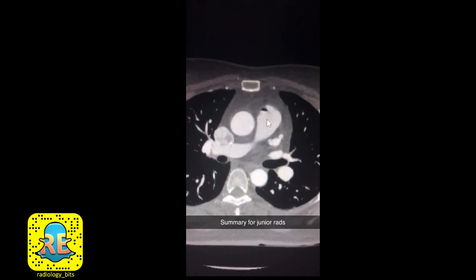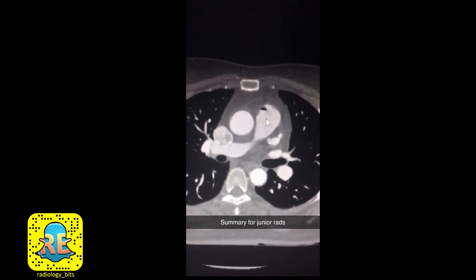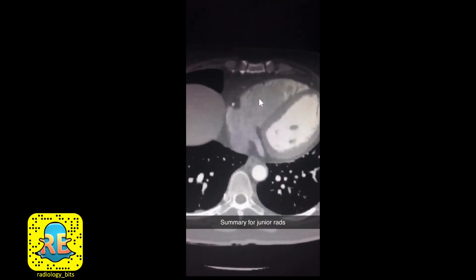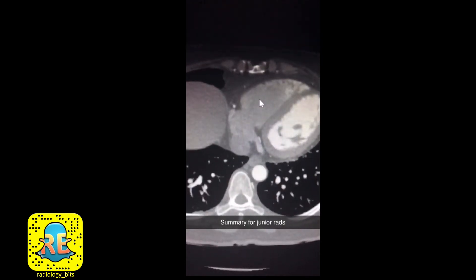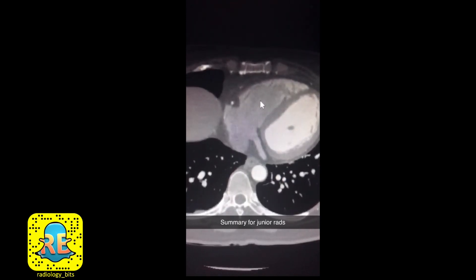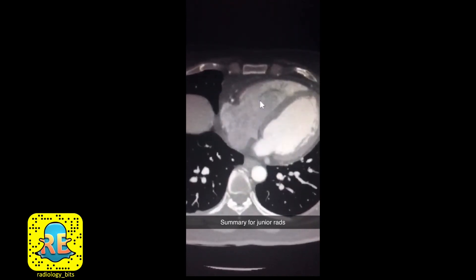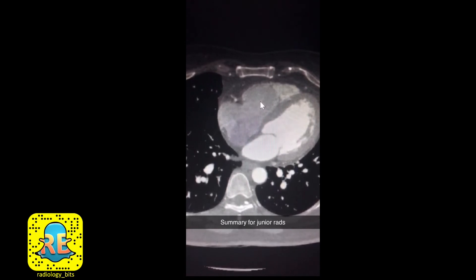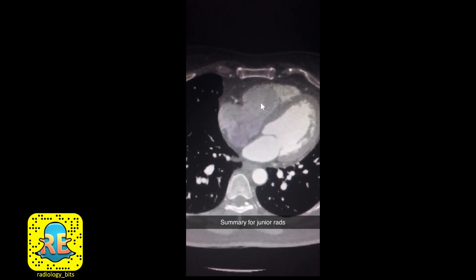To summarize for the junior radiology resident: seeing a few tiny air bubbles within the pulmonary artery and the right ventricle is not unusual. It's something you might encounter occasionally and it's a finding to ignore. This is not an air embolism — the reason is the IV access.